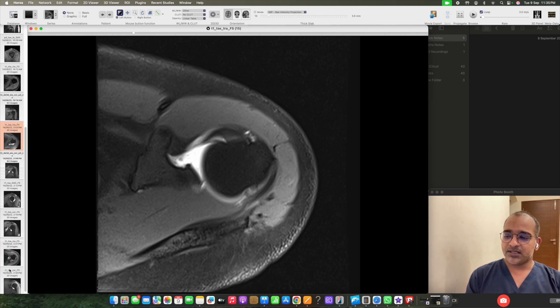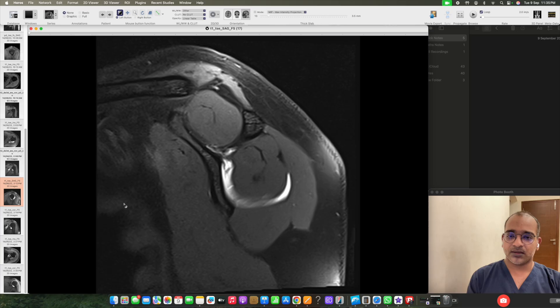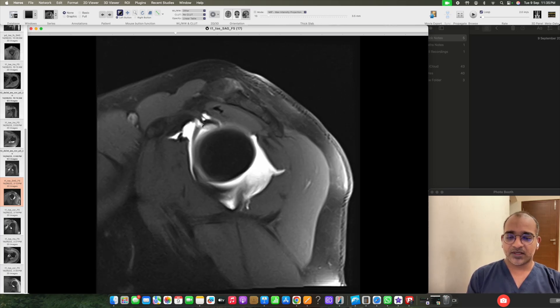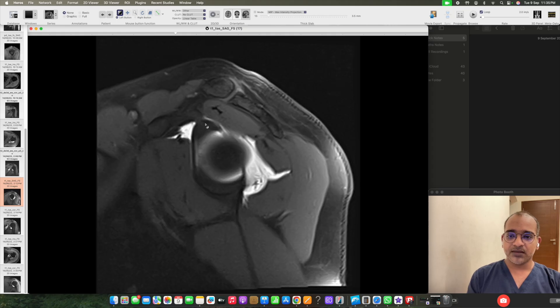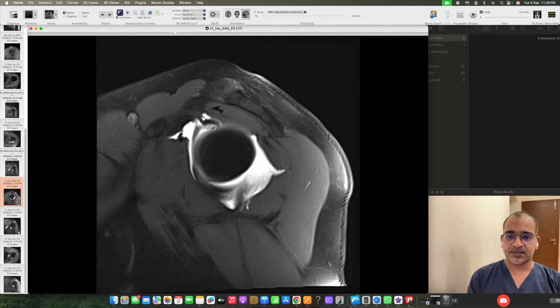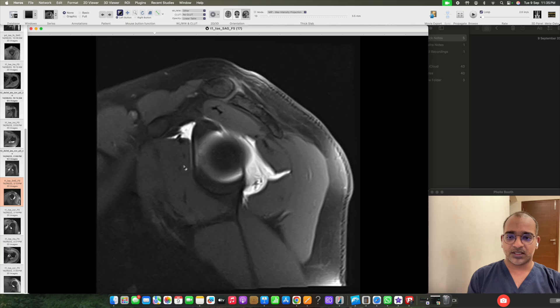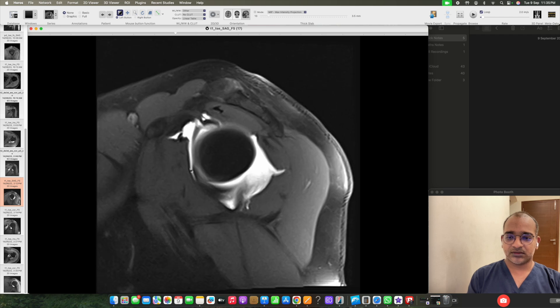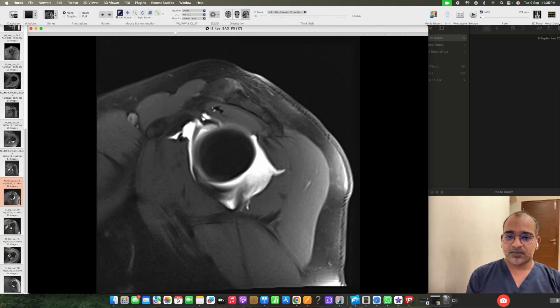On the sagittal arthrogram images, this is the coracohumeral ligament, this is the long head of biceps tendon. This is the superior glenohumeral ligament. Then we have the middle glenohumeral ligament and inferior glenohumeral ligament. The inferior glenohumeral ligament is divided into three parts — anterior, middle, and posterior. This part we are concerned about is the rotator interval.